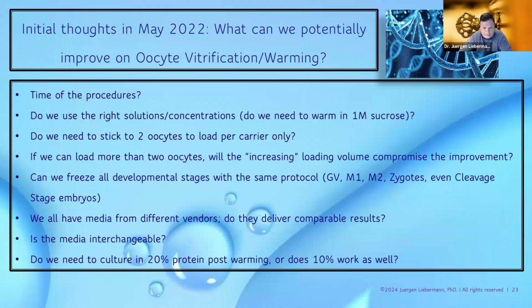We all have media from different vendors. Do they deliver comparable results? And if so, are these media interchangeable? And finally, again, do we need to culture in 20% protein post-warming, or does 10% work as well?